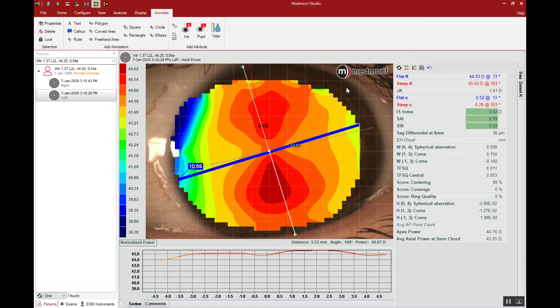The Medmont is going to be an important tool in your pre and post fitting orthokeratology analysis. There are many things you can do to help determine the appropriate initial custom lens parameters so that you can achieve the highest first fit success possible.